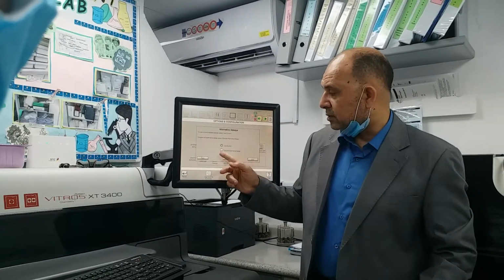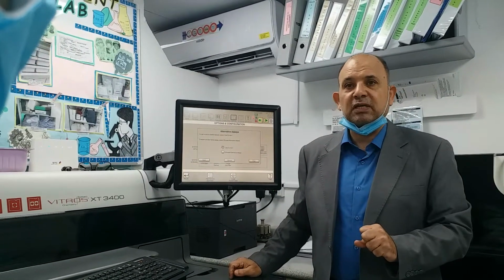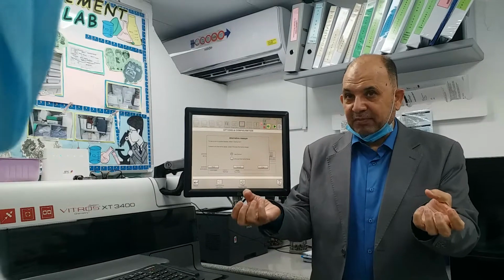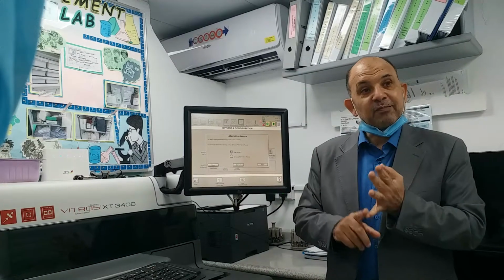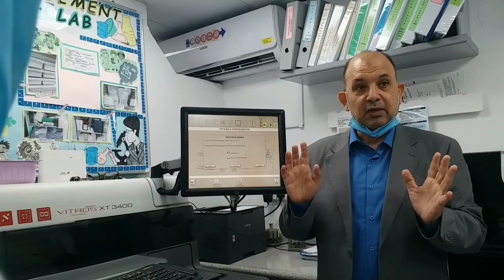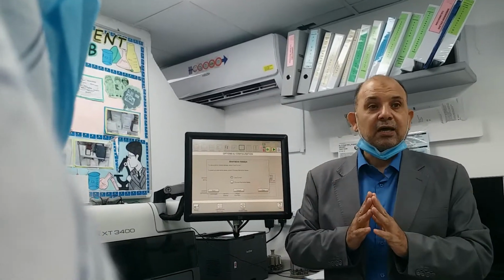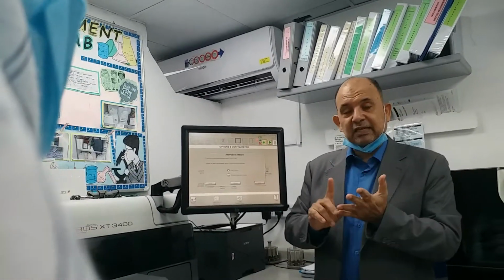Now, use current or choose alternative assay. This is not affecting this one, but it's affecting some other instruments. Like for ALT, I have ALT and ALTV, right? So what is the difference between both of them? A lot of difference. The AMR between ALT and ALTV is completely changed. That's number one. LDH and LDHI are completely different. The reference range, the AMR, a lot of things will change, even in the structure of the slide for this test and this test. Okay?